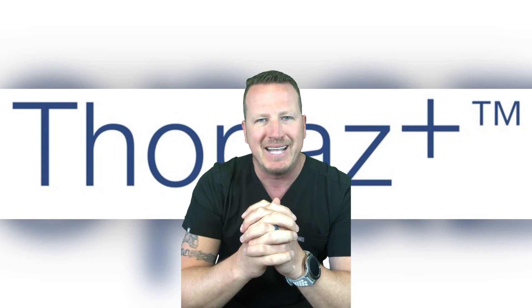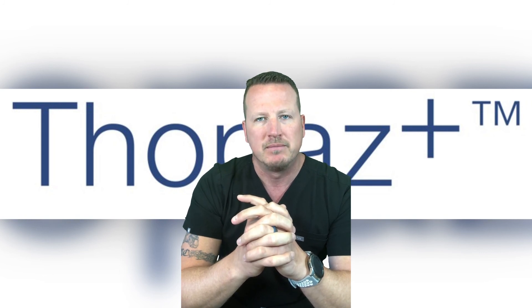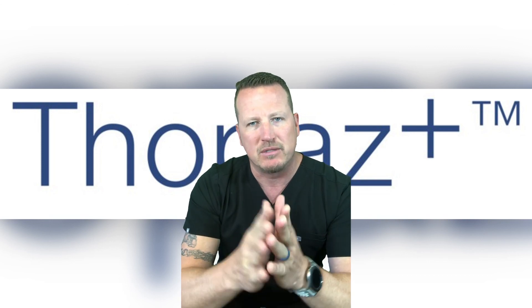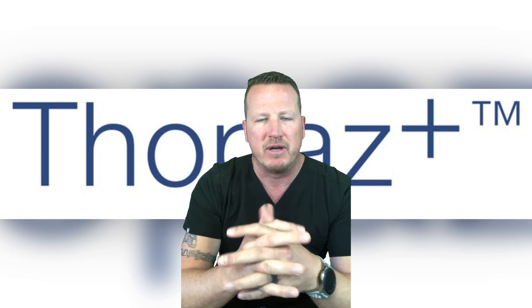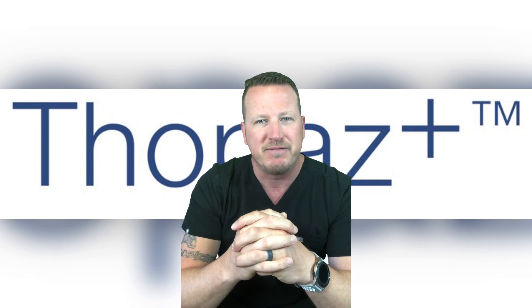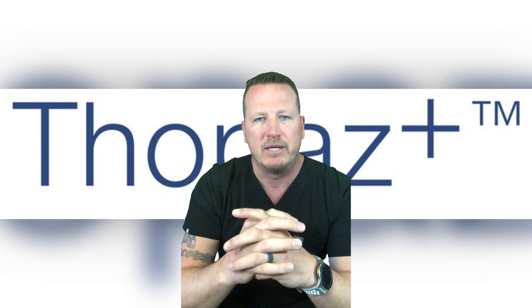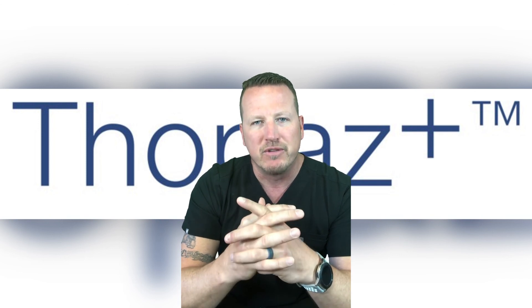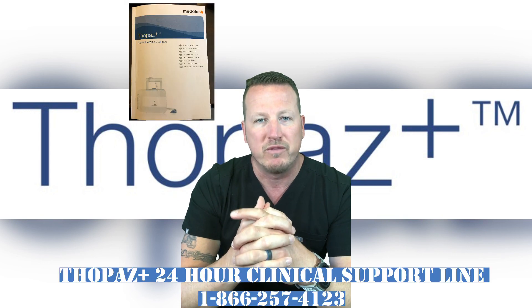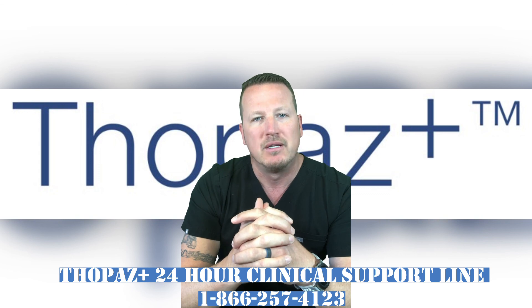Thopaz and Thopaz+ have over 10 years of clinical experience in digital chest drainage and have served over a million patients worldwide. They are ideal for application in any ERAS initiative, be it thoracic or cardiac. The proprietary algorithms used in these devices are based on 60 years of suction technology as well as over 10 years of customer experience and feedback, and have been engineered to be patient-centric and customer-friendly. Medela is the world leader in digital chest drain technology. For additional information, please reference the Thopaz+ IFU or contact the Thopaz+ 24-hour clinical support line at 866-257-4123. Thank you so much.